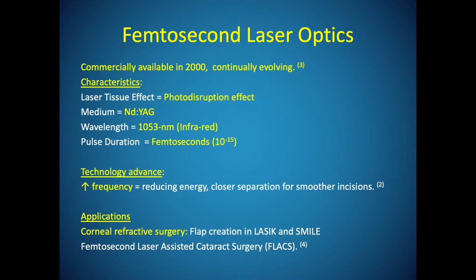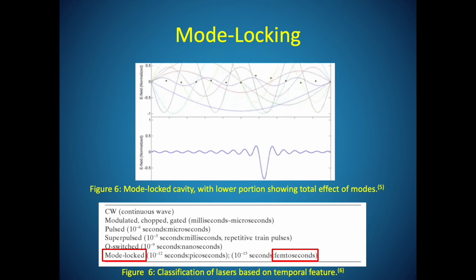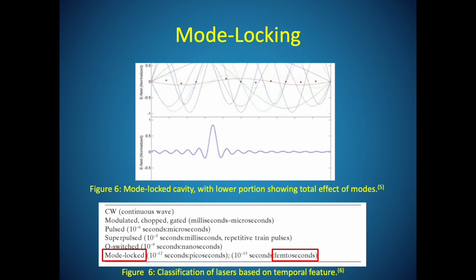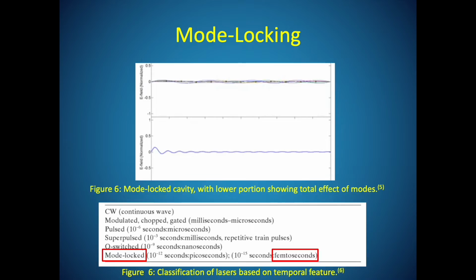This technology is replacing the use of the microkeratome during flap creation for LASIK and is offering lenticule extraction with SMILE. Producing pulses in the femtosecond range is achieved by mode locking, where many oscillating modes of different frequencies constructively interfere to become locked in phase.